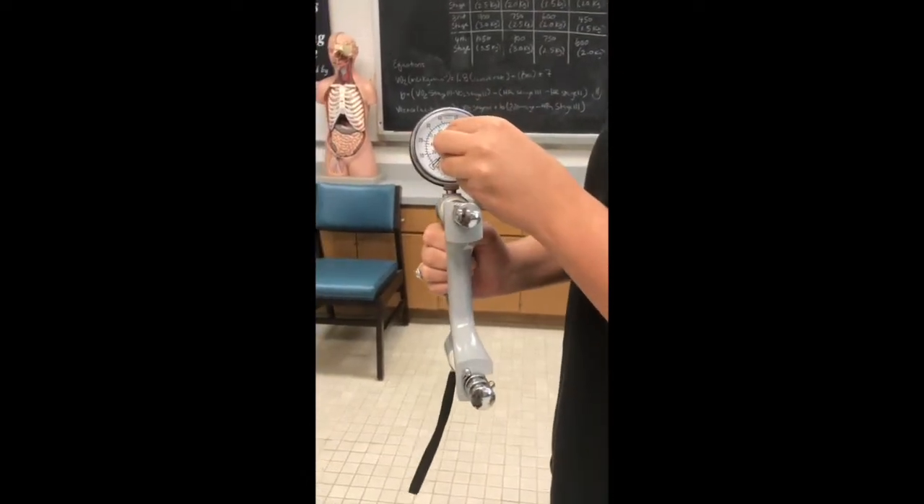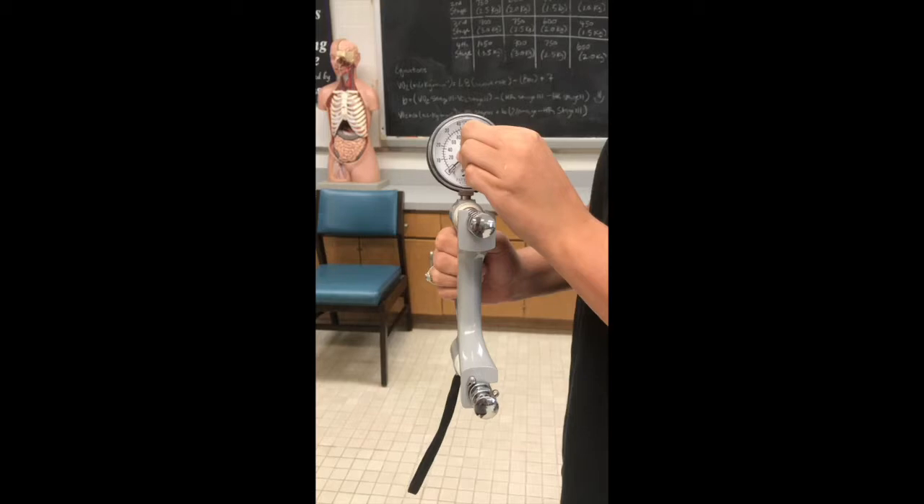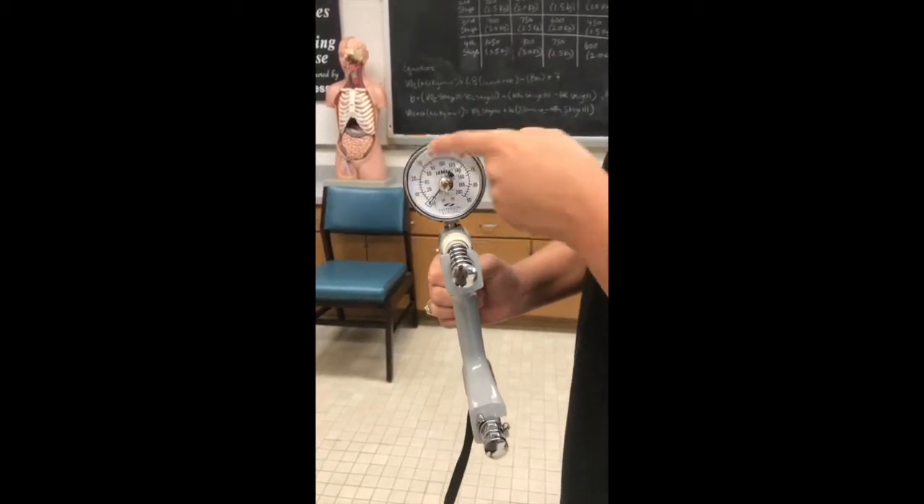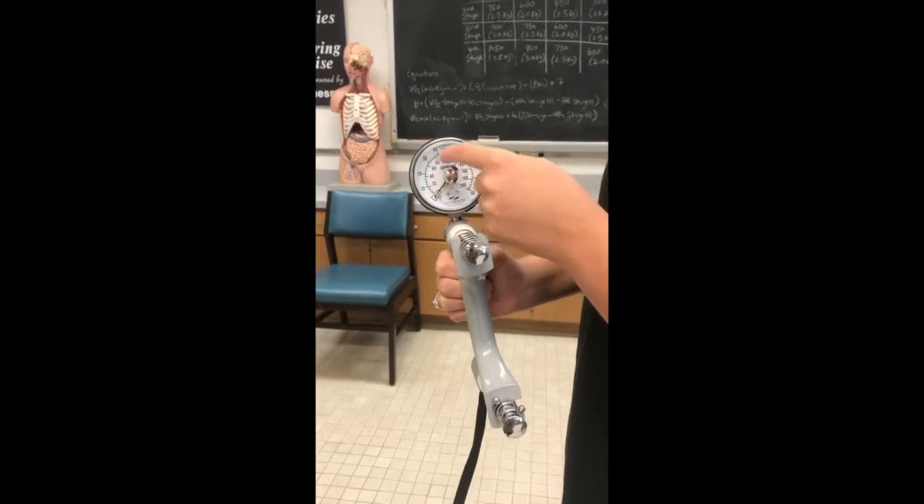Here we have the pin on the dynamometer. We want to make sure that's set to zero. When reading these values, kilograms is at the top and pounds of force is at the bottom.